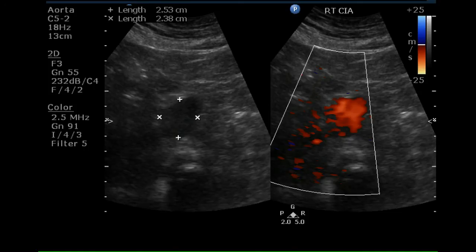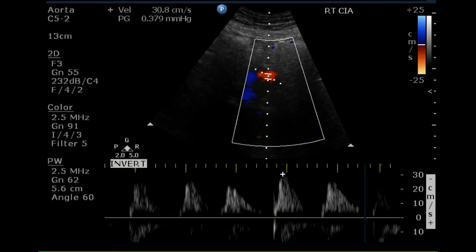This is a side-by-side image, gray scale and color Doppler of the right common iliac artery, again demonstrating the enlargement. The pulse Doppler waveform within this artery is abnormal, demonstrating no reverse flow, although high resistance blood flow is present.